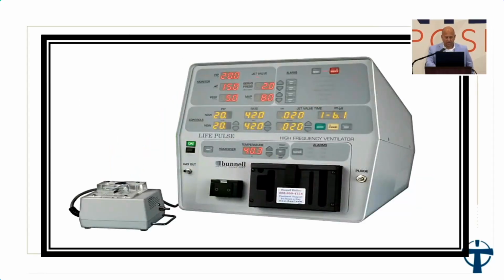This is what it looks like. It's really heavy. It's obnoxious. Again, it's loud if it goes off. And the difference with this ventilator compared to any other ventilator is that you have to put this back on the patient's ET tube, connected, before you start it again, because it tries to generate pressure against resistance. So if you have it open to the atmosphere, you put it in your patient, you're going to have the largest pneumo you've ever seen in your life. So you have to put it on the patient first, then start it up. So it's a great learning curve.